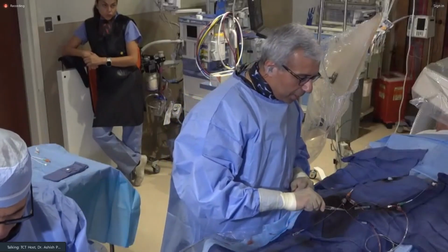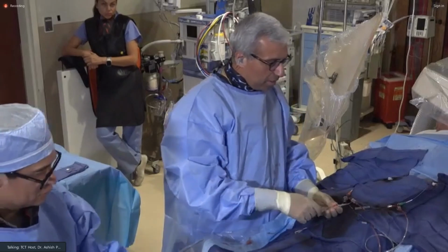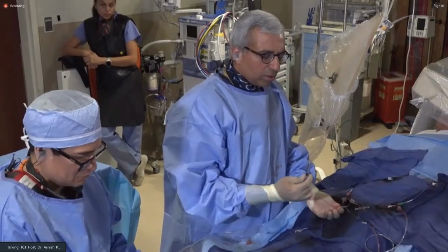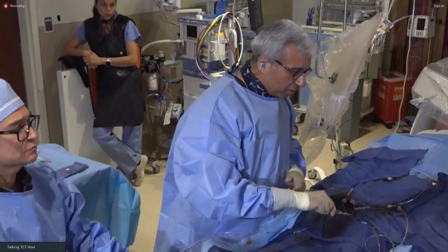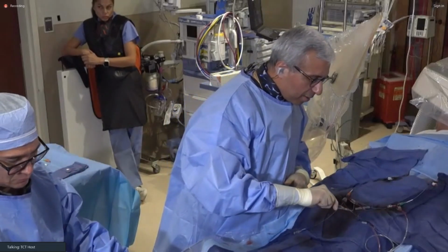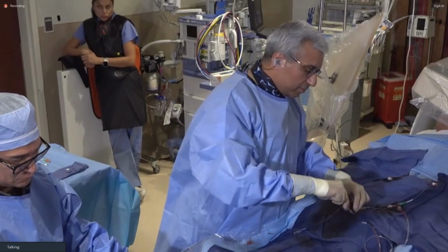I think there's no downside to doing that so long as you're not at a branch point. So, Dr. Tiwari, what are your thoughts here? The goal is to do knuckling anyway, so it doesn't matter. What is your thoughts on the next wire, next approach? What is the preferred wire? Yeah, exactly. Retrograde.